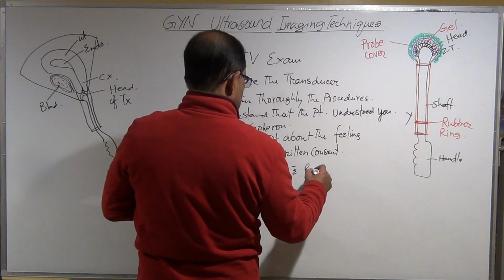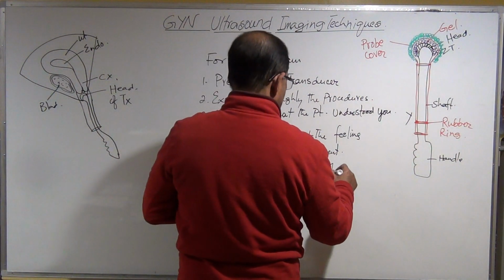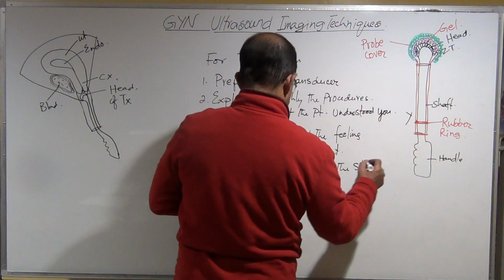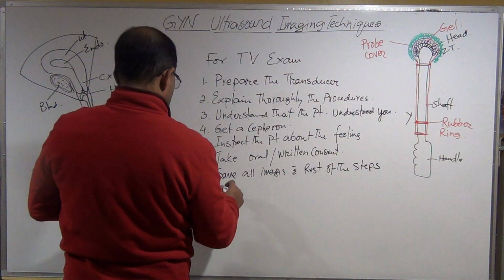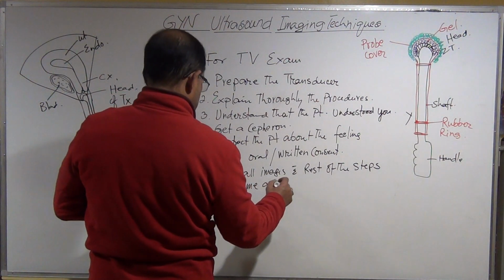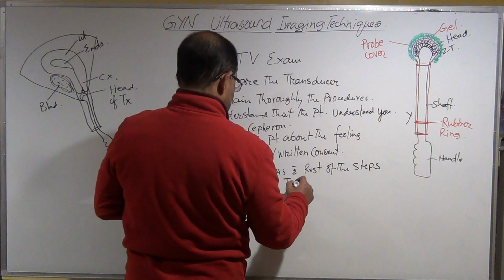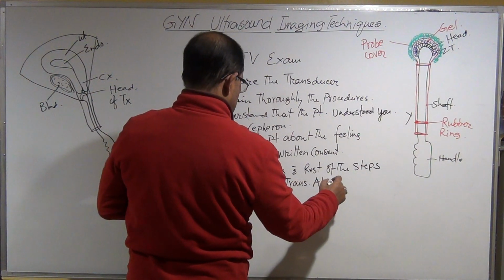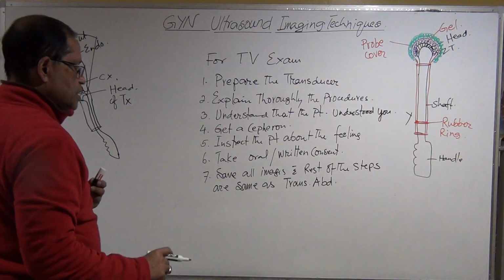And the rest of the steps are the same as the transabdominal procedure.